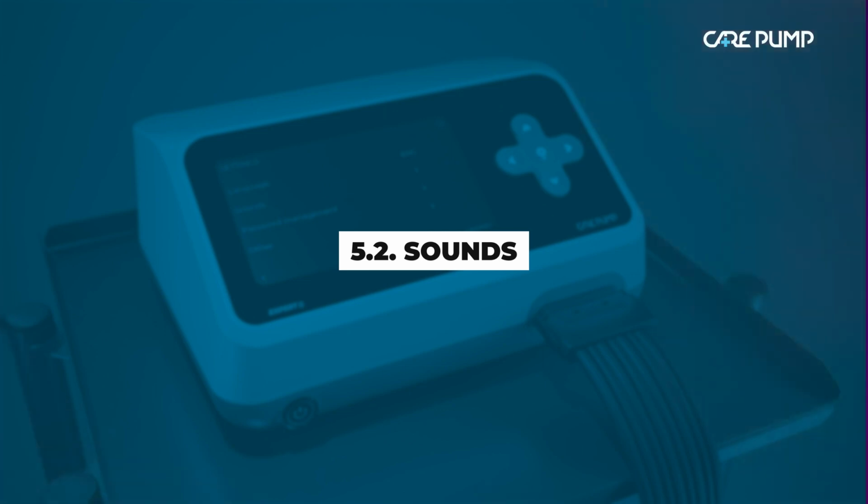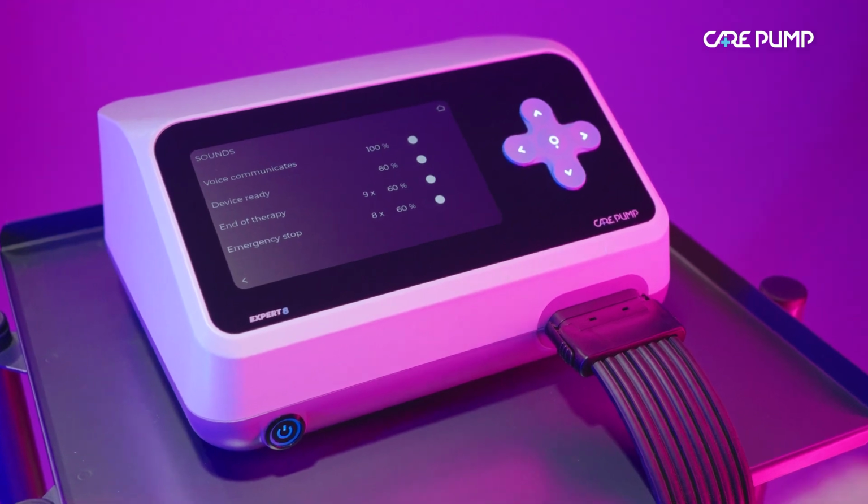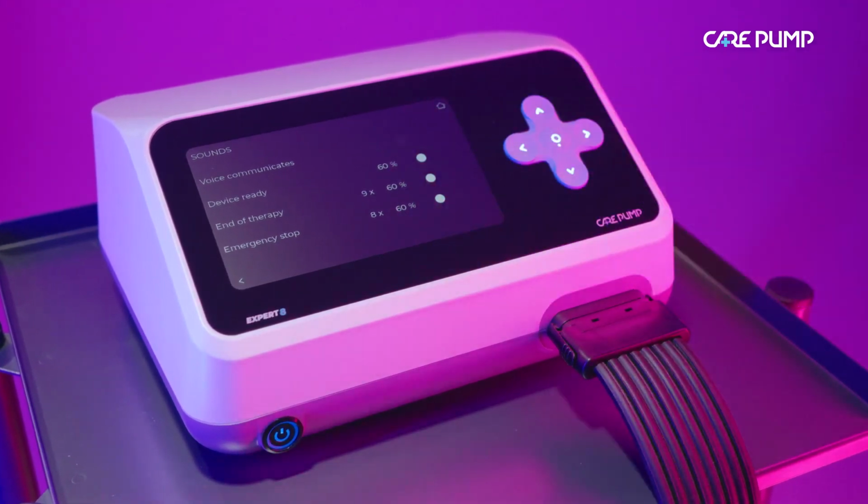Sounds. Sounds option allows you to define the volume and frequency of notifications and voice messages. To enable or disable notifications, voice communicates, device ready, end of therapy, and emergency stop using patient safety button, press the button next to each of these options.